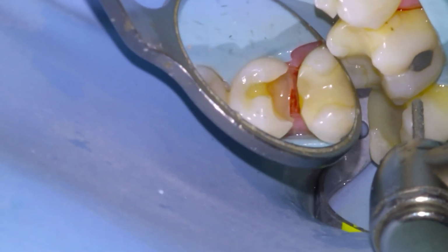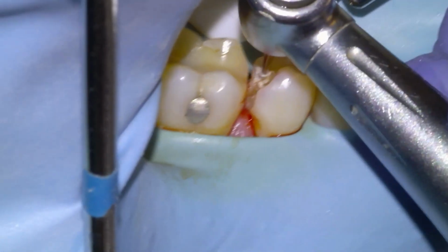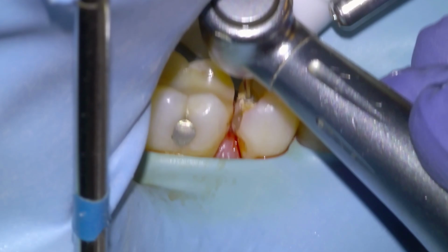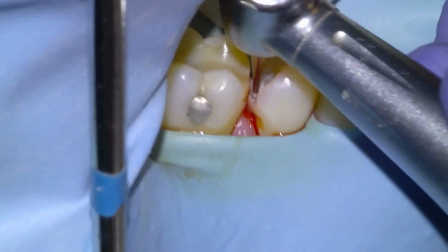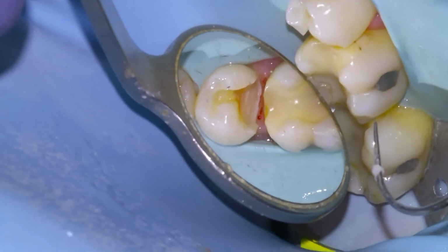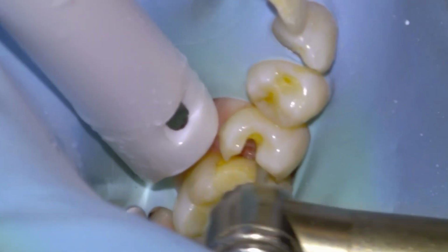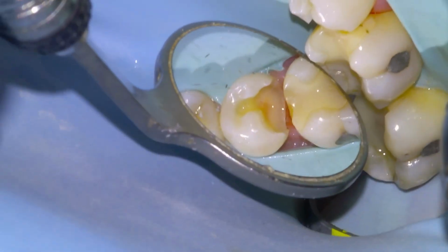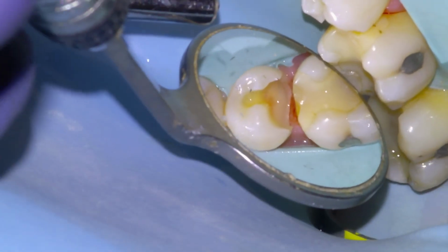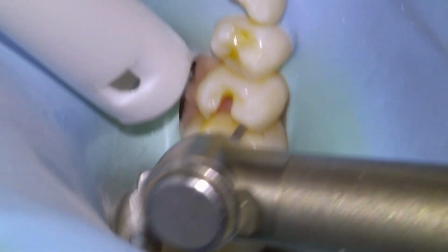We're getting pretty close there, just a little bit more decay on that lingual aspect, so we're going to whack that down with our slow speed. And once we've done that, I think we're pretty much going to be ready to restore. A little bit of thin enamel flakes, so we are going to remove some undermined enamel with the high speed. And then you can see a little bit of blushing on the pulpal floor there. That little bit of affected dentin isn't too much of a concern.